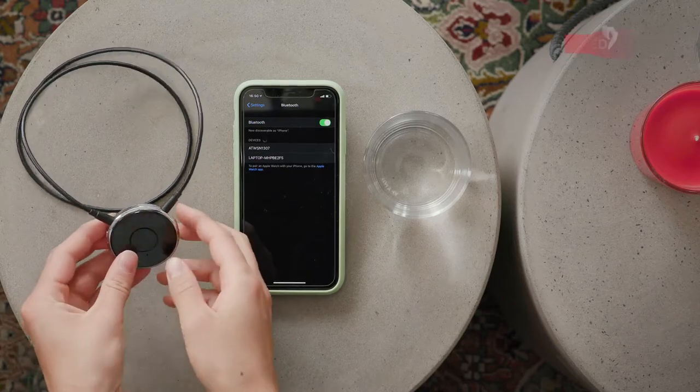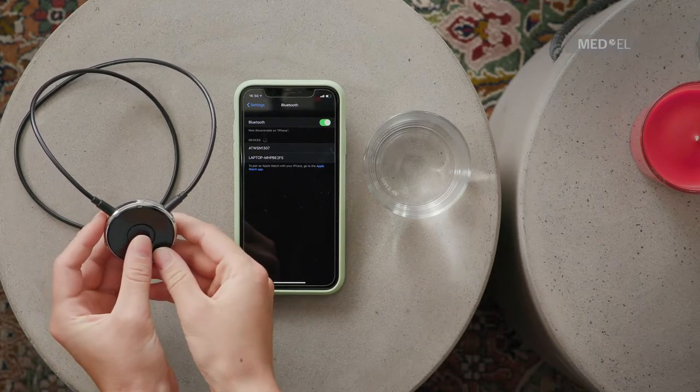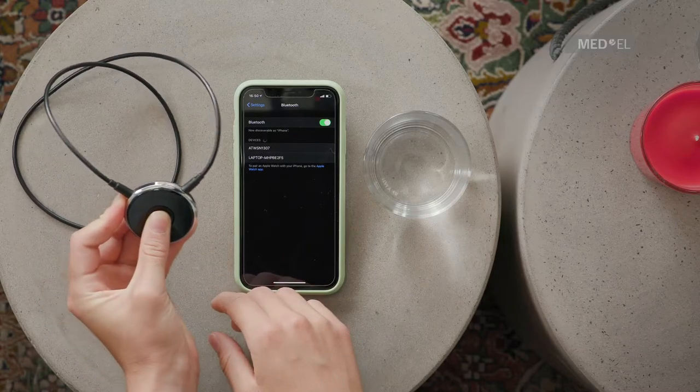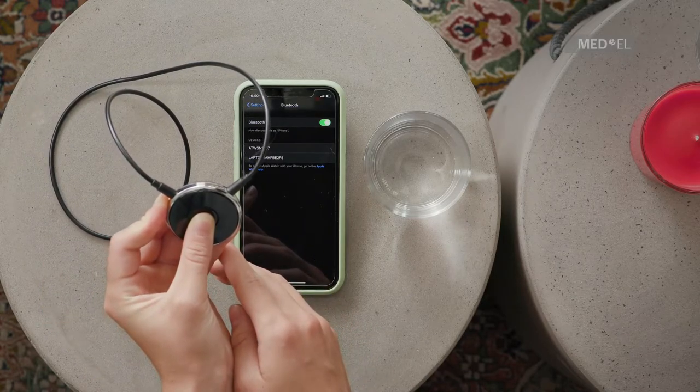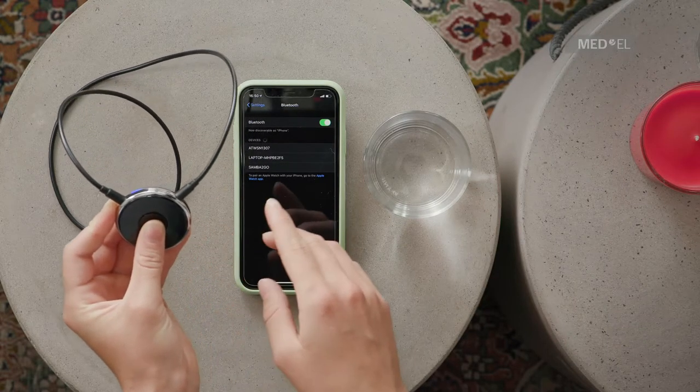To pair with a Bluetooth device, switch on Samba2Go and your Bluetooth device. Press the multifunction button and the upper volume button simultaneously until the blue LED flashes. This takes approximately five seconds.